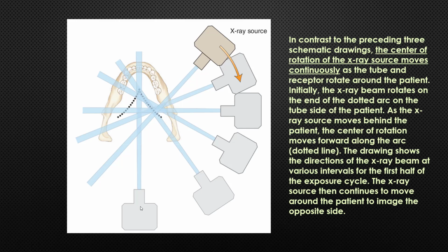And then right here, this would be what? The midpoint of the image. You've captured half the image. You've captured the patient's entire left side. And then it would continue going around until it captured the right side just the same.